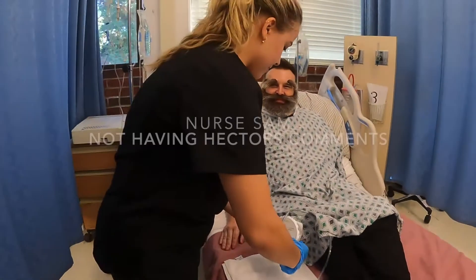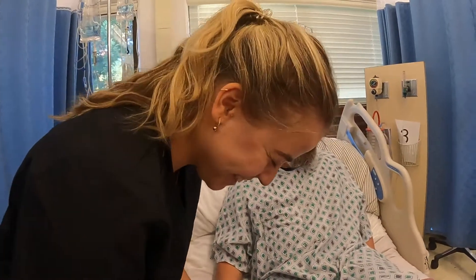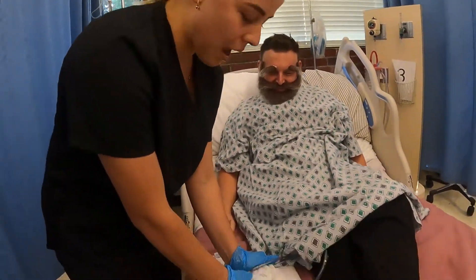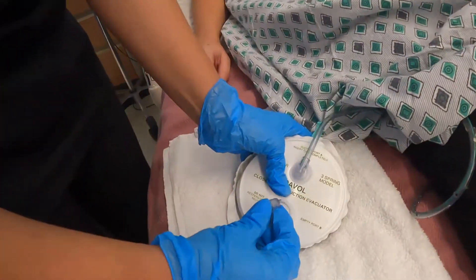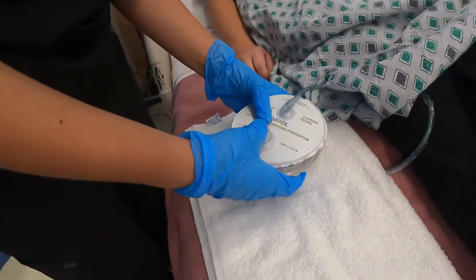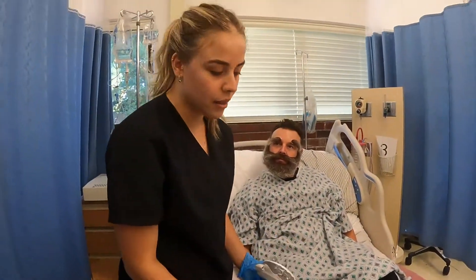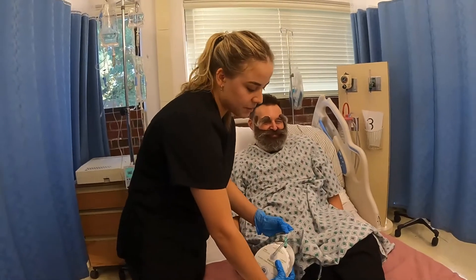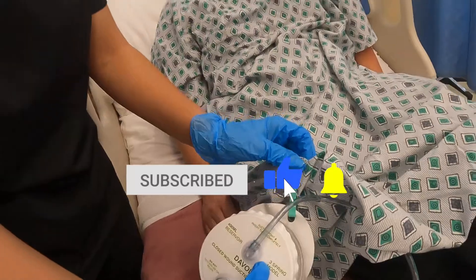It looks like urine. We're done with the silly comments — we're going to keep squeezing and then put the cap back on. We also want to make sure this isn't going to tug on or come out of the patient, so it's going to be clipped to the patient's gown. Thank you.